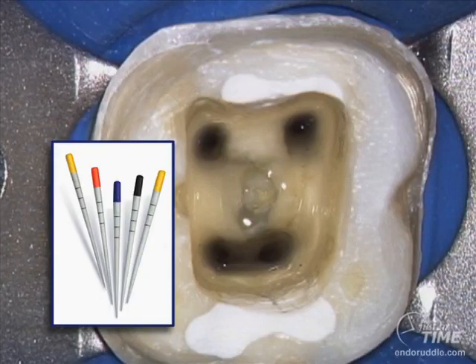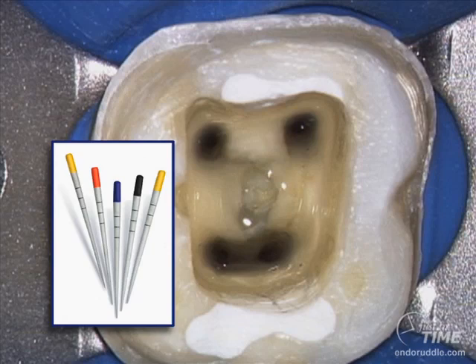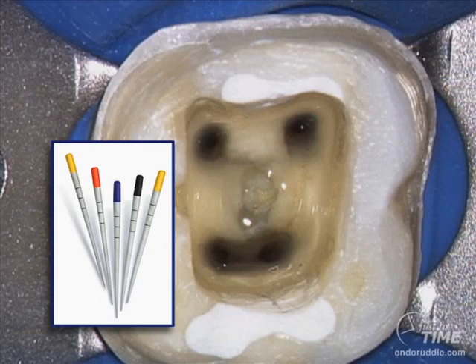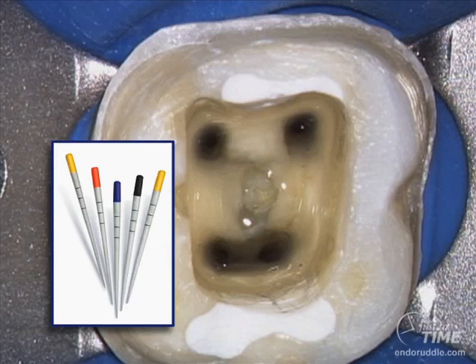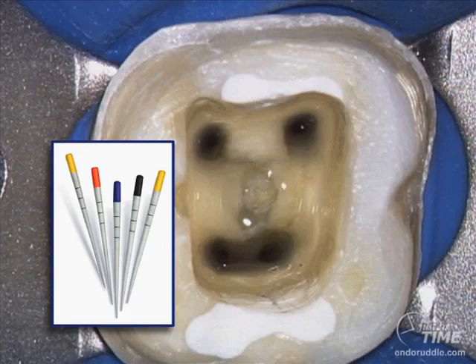We can use suction to aspirate out most of the reagent from a well-shaped canal, but you will need a few paper points to wick out and absorb moisture from the apical one-third. Paper points are appropriately sized based on the system you used — in this case ProTaper shapes, so ProTaper has matching paper points. You can see their convenient gradation lines on the more proximal side of each paper point.